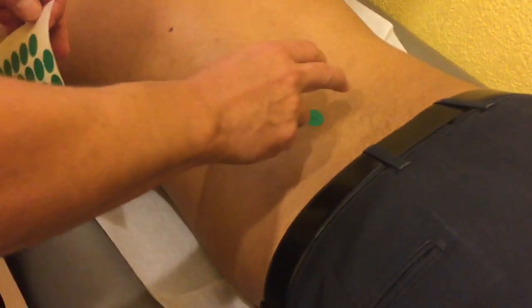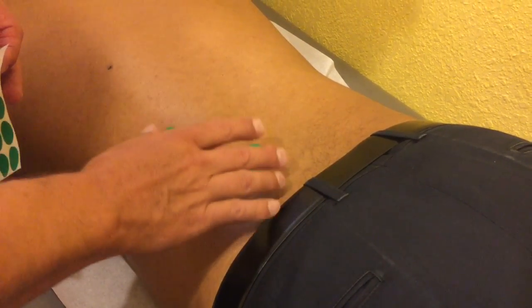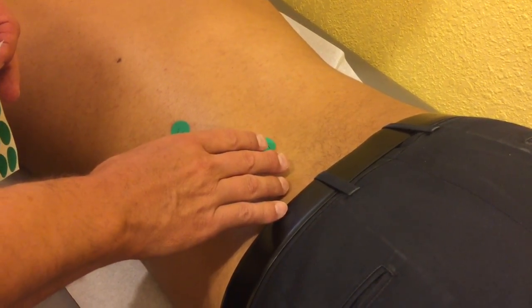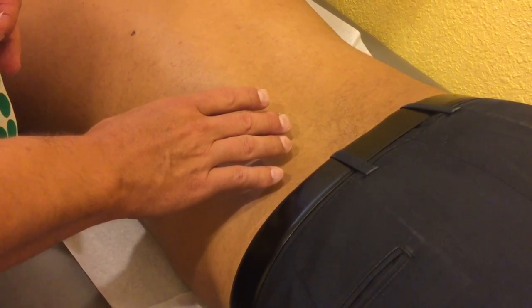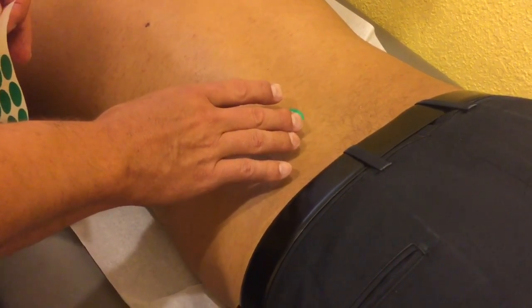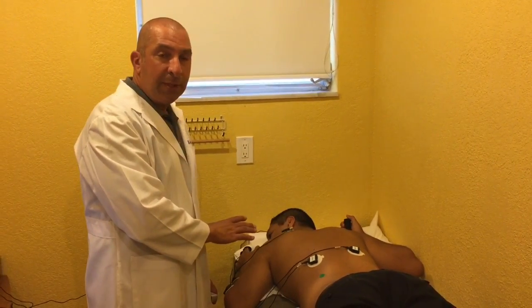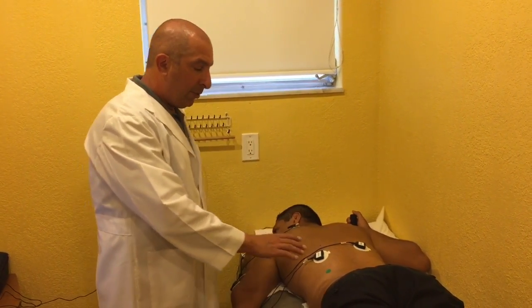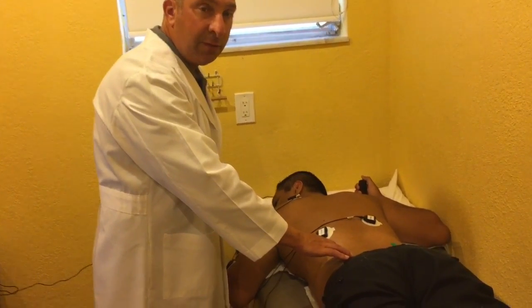We're also going to identify a symptomatic and control site on the other side, and this is what we're going to be using for testing with algometry. You're going to use the same system for identifying pain and pain rating if you're testing range of motion and for nerve testing. Patient setup has been completed. We have identified 2 symptomatic sites of tenderness.